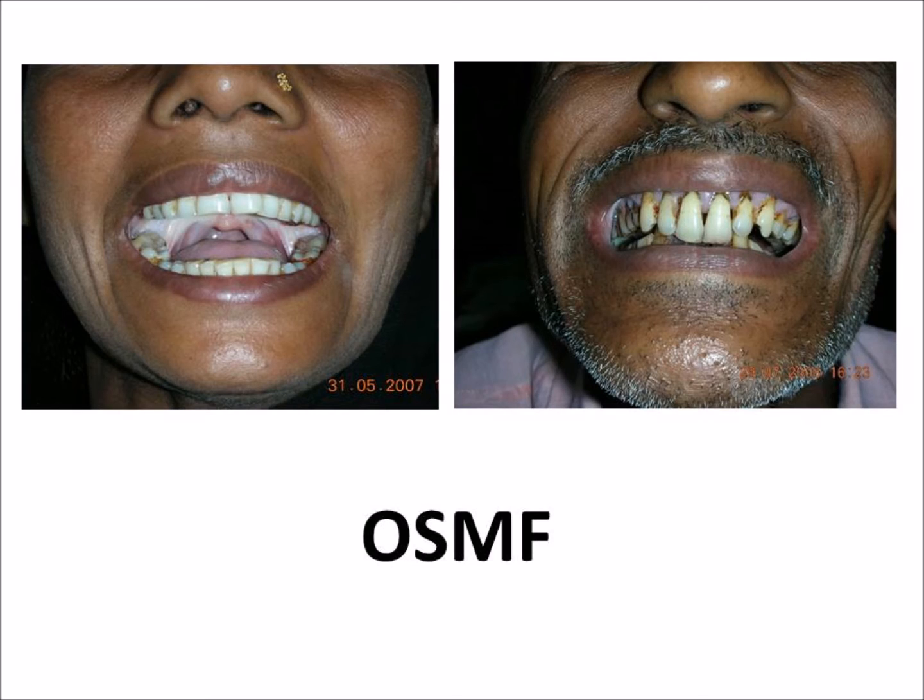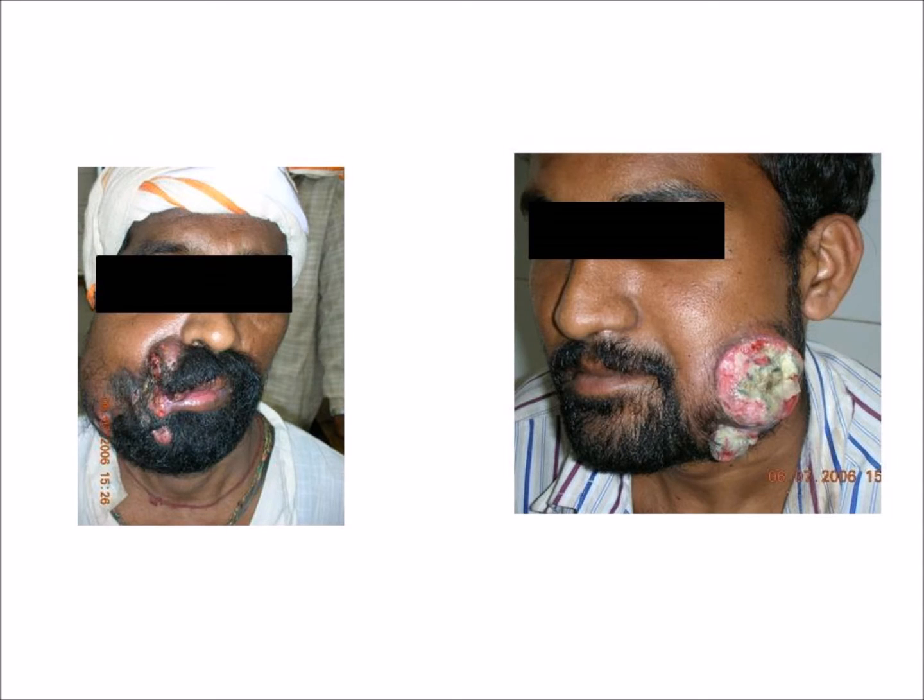This patient has sharp teeth, chronic injury. You see that there are no everted edges, there is no cauliflower-like growth, but there is an ulceration which has a necrotic slough covering it, and it is a traumatic ulcer or a dental ulcer.